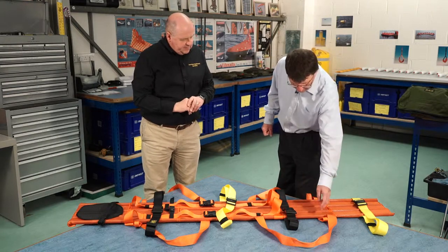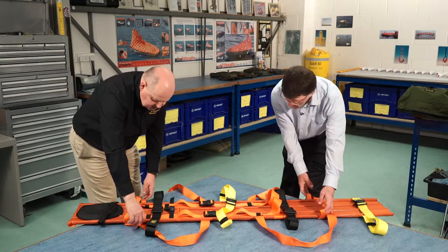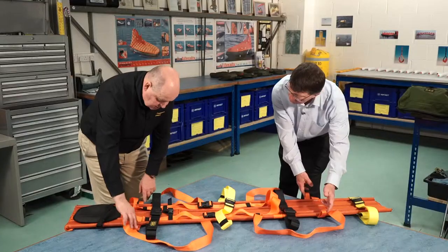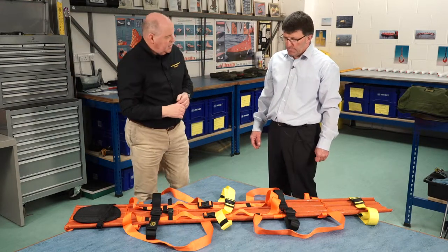I also noticed there are some little loops on the stretcher — what are these for? We have four security loops strategically placed for balance. If you lift these, it's for horizontal lifting — this can be done by a winch or even a helicopter, and we have a set of straps that come up to a central point so you can lift the patient that way.